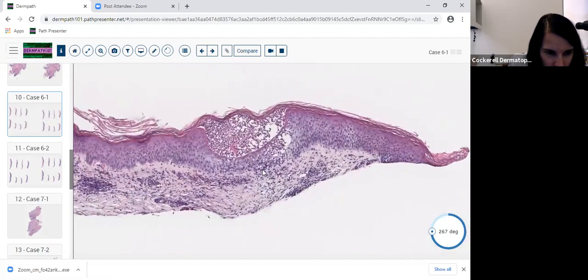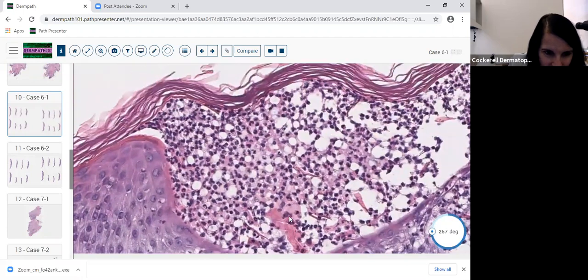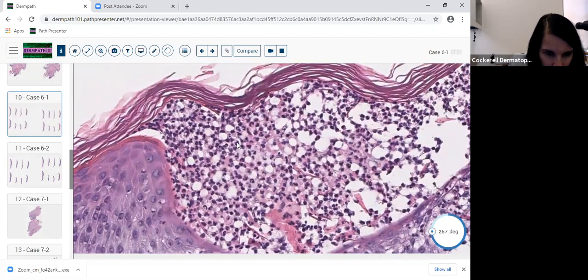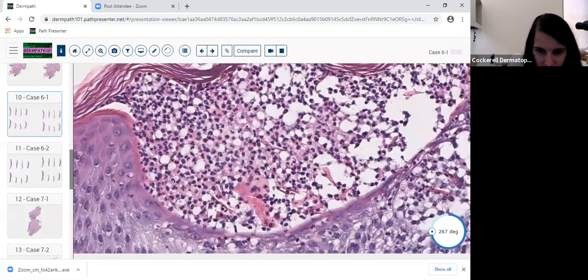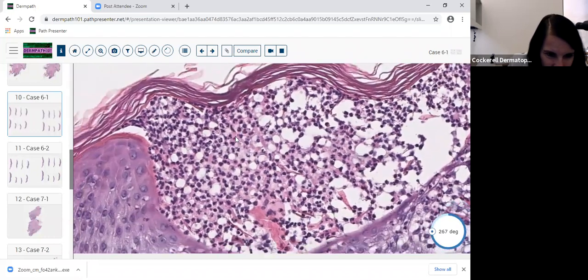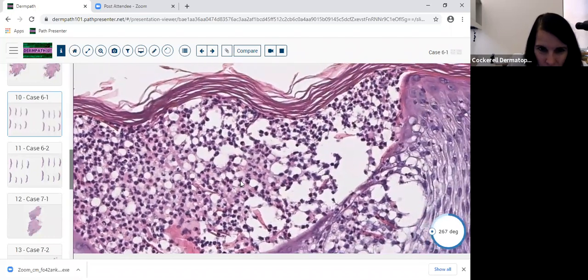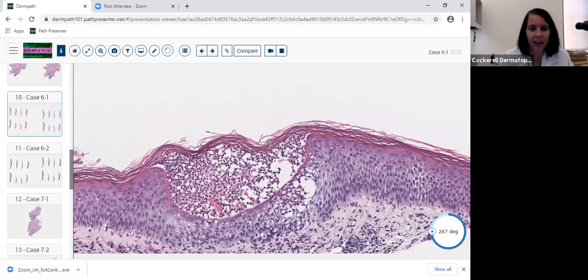Uh-oh, there's a pustule. And if you look on higher power, it's somewhat messy looking, these cells. When the cells look messy and they have multiple lobes, those are neutrophils, polymorphonuclear leukocytes, multilobated, so-called Mickey Mouse ears. They look like Mickey Mouse ears. So this is a pustule, and it's subcorneal. So you may go off the rails and say, oh, it's pustular psoriasis. It's Sneddon-Wilkinson. And you're saying all this differential.